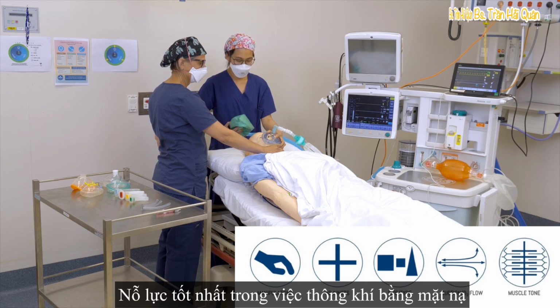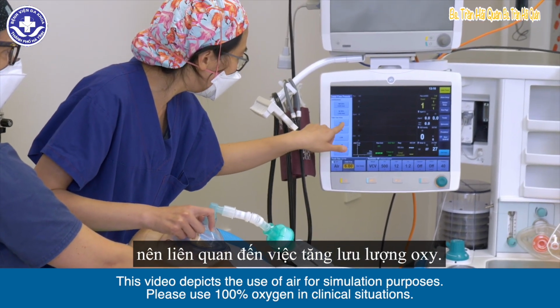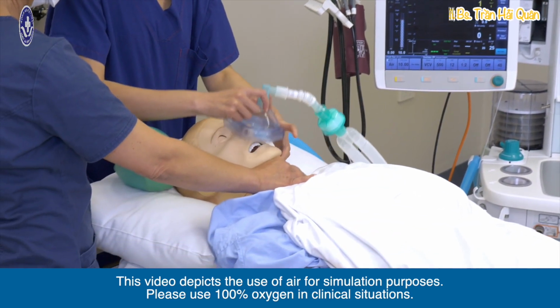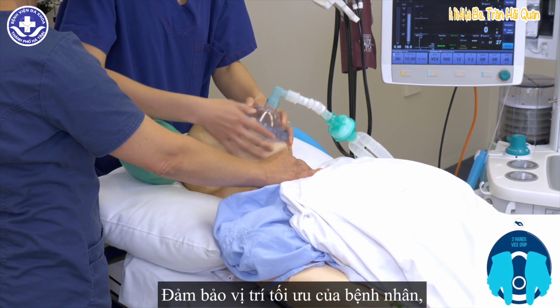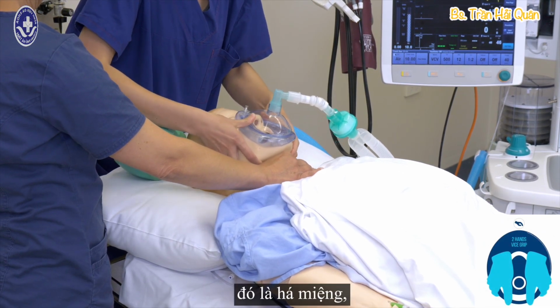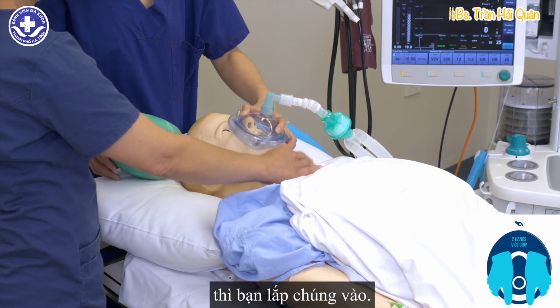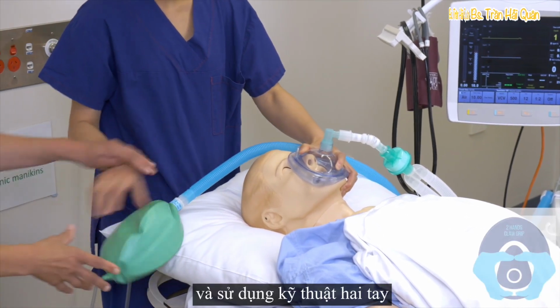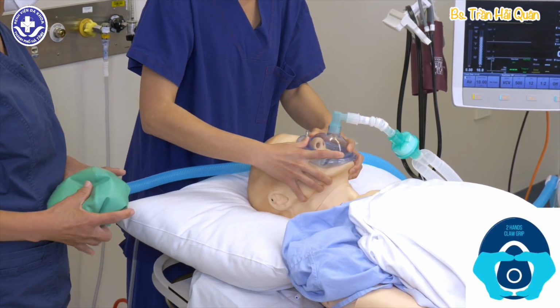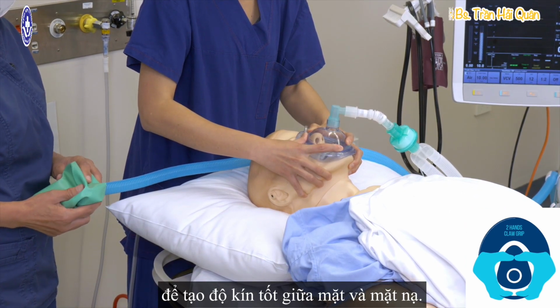A best effort at mask ventilation should involve increasing the oxygen flow, ensuring optimal positioning of the patient, that is, opening the mouth, jaw thrust, and chin lift. If the patient has dentures, you leave them in, removing cricoid pressure, and using a 2-handed technique to create a good seal between the face and the mask.